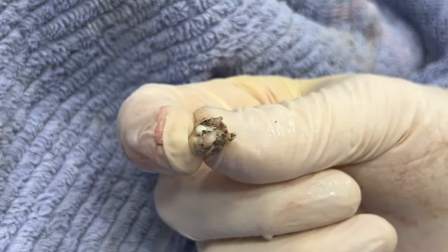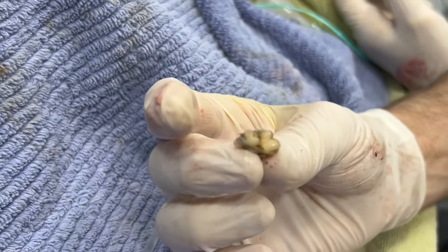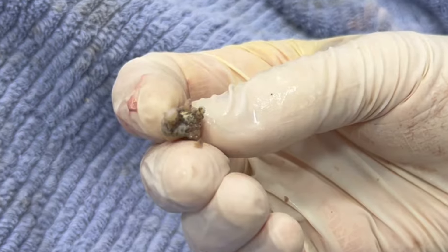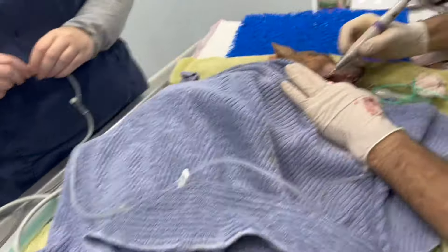That is a really rotten molar tooth. You can see these are the roots sticking out into the mouth. Look how rotten it is — can you imagine how painful it is? It's infected and painful. This pet is so lucky to have this tooth out.